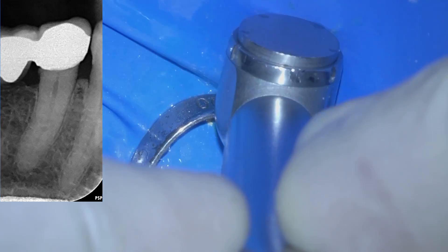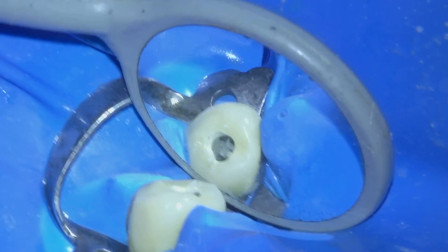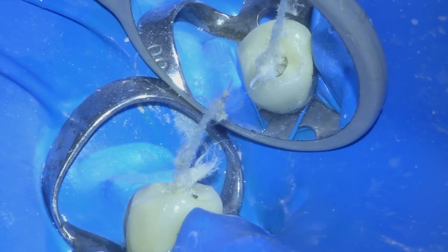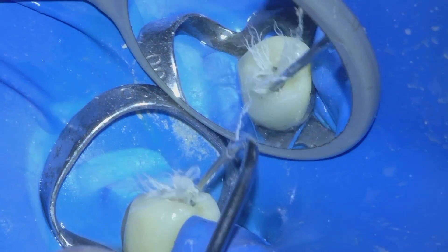In this case the referring dentist placed a cotton pellet under the temporary filling. Nowadays it is preferable to use PTFE tape under the temporary filling instead of cotton or sponge pellets, because it is much easier to remove and PTFE tape is associated with less bacterial contamination than cotton.